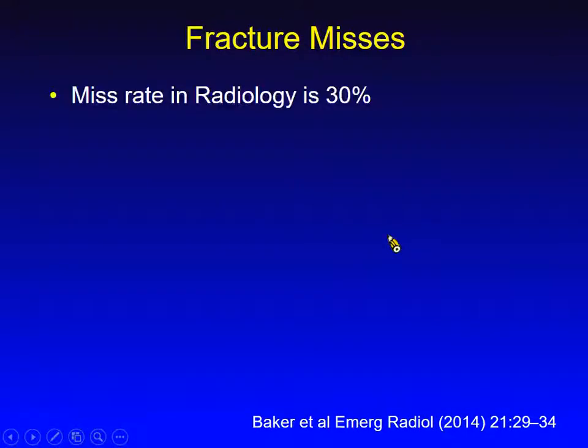All right, so fracture misses. One thing to remember is that we're actually not that good. We miss about 30% of findings.